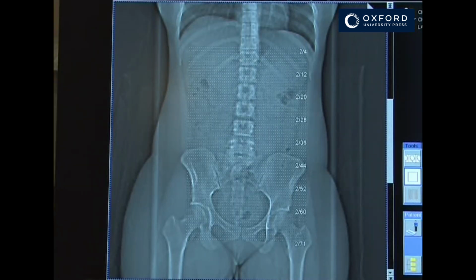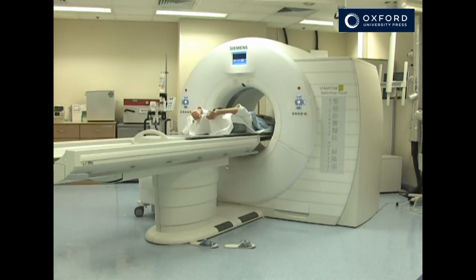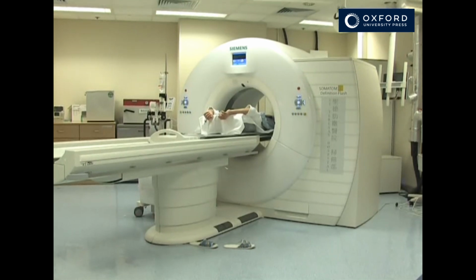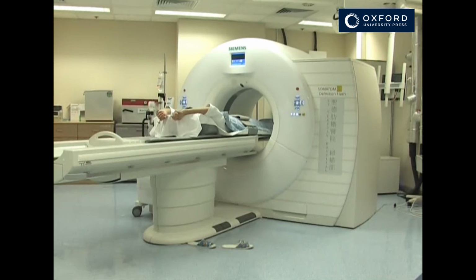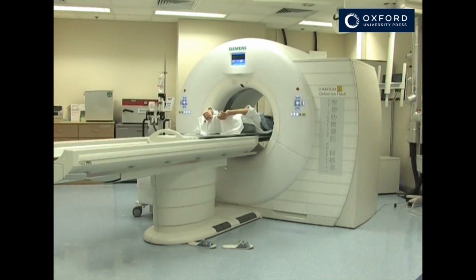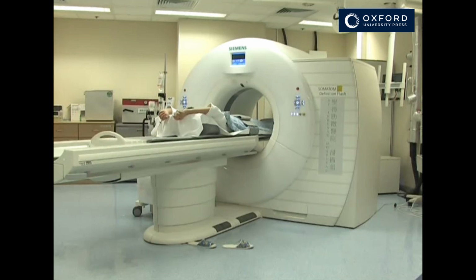An initial low-dose scan is performed to show a rough image of the patient's body. The radiographer will use this to plan the subsequent scans for the part of the body of interest. Once the coordinates of the scans are confirmed, the scanner starts and the patient passes through the scanner. Contrast medium, if required, is injected now to coincide with the scanning. Several passes may be made if we want to see different stages of contrast enhancement.